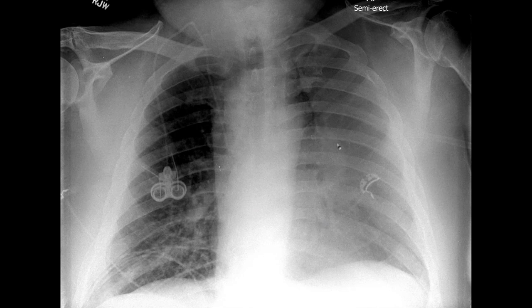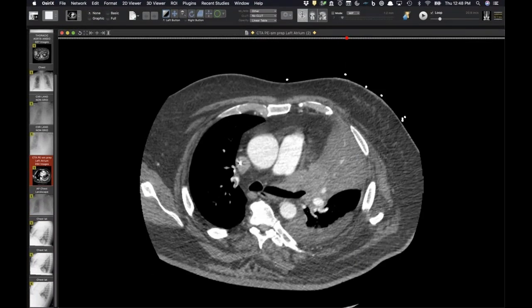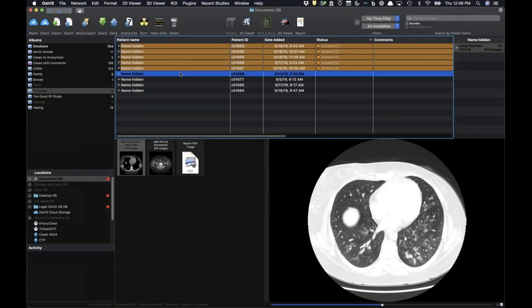But the one I think I noticed, because I think I see air in distal left main bronchus, is that it's fairly horizontal in its orientation. Right here. Yeah, it's just pulled up. So a couple of subtle additional findings that go along with an obstructive lobar atelectasis case. Okay. Yeah, nice case.